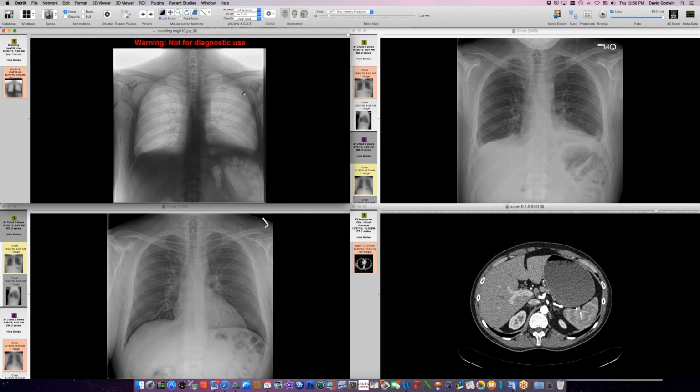When he was put supine, in the previous frames that I showed you, he lost some of this excursion, so it got even worse. So we think this is, I mean, he's got sky-high CPKs and aldolase and so forth. So he's got a myositis that is involving muscles in his body. He had a hard time putting his arms up over his head for the fluoroscopy, and it's shared by his diaphragm muscle as well. So this is a myopathy probably from his graft versus host disease.